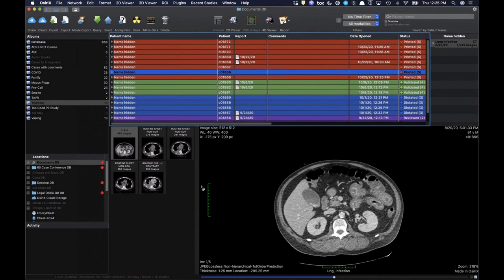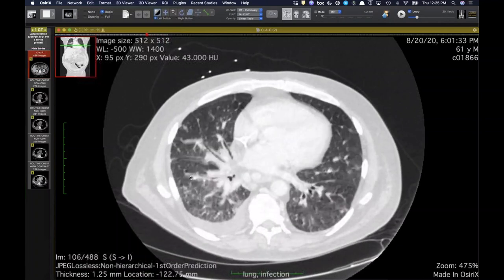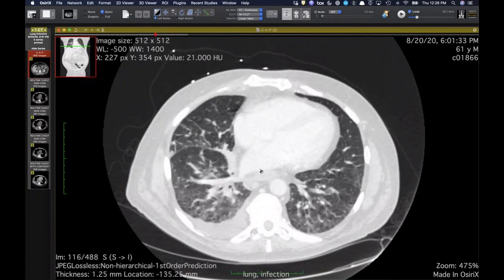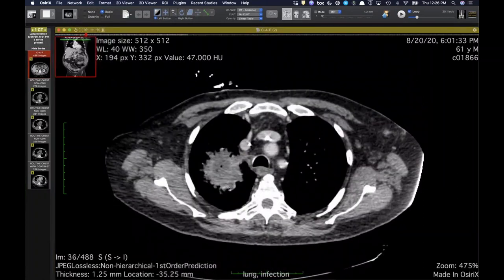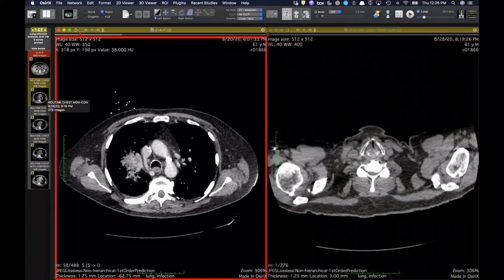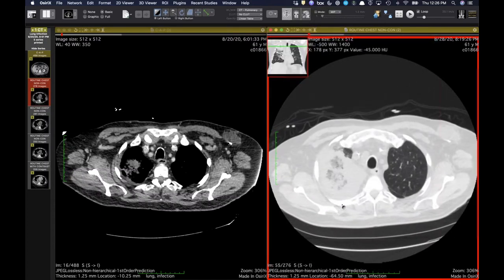All right. Let's see which. This is a patient that's had several images, but I think it really only takes one. I show this because we have histologic proof, and it's a very nice case. So this patient has some sort of hematologic malignancy, and this is after initiation of chemotherapy, and they're neutropenic. So in the lower lobes, they have a lot of pleural fluid, some peribronchial cuffing, and of course, neutropenic fever at this point. And so this one, you can see there's the central lower attenuation. It looks like it's starting to develop a bird's nest appearance to it. And then I'll show you over the course, and this was new from a prior PET CT a few months prior. And then here it is a few weeks later, even on a non-contrast CT, and you can just see how this looks like a big infarct with a reversed halo appearance to it.